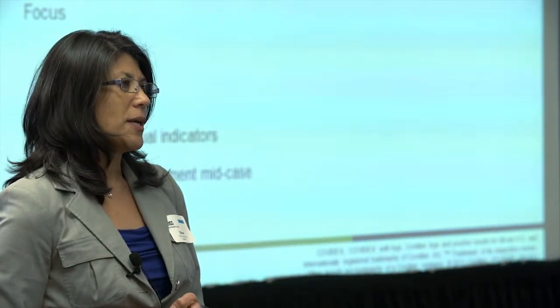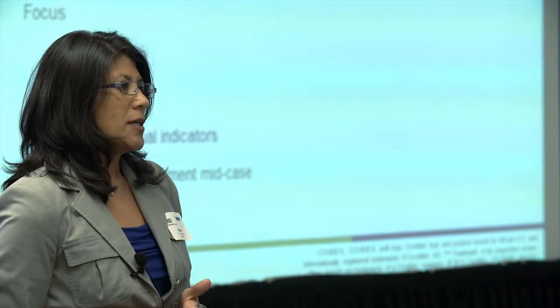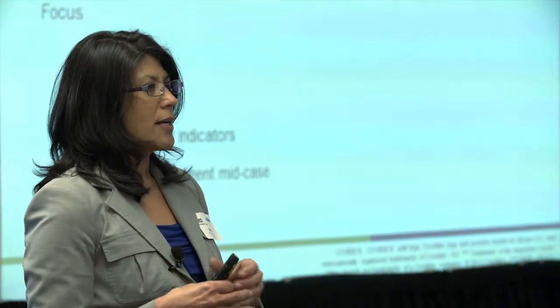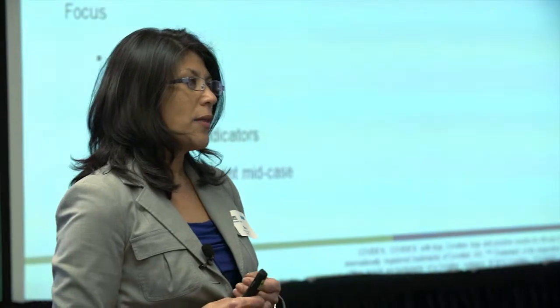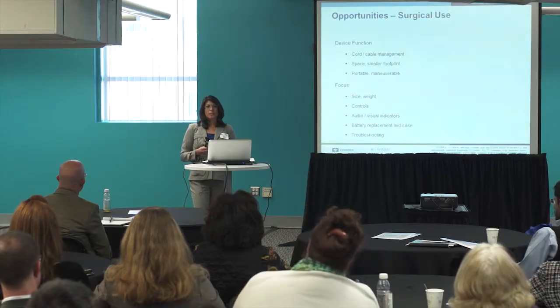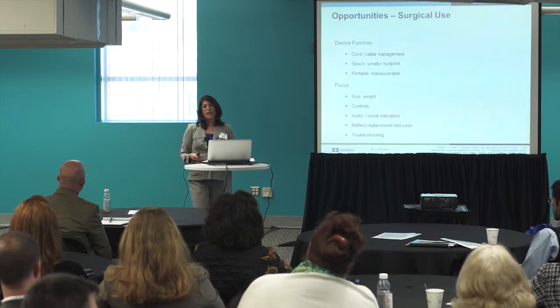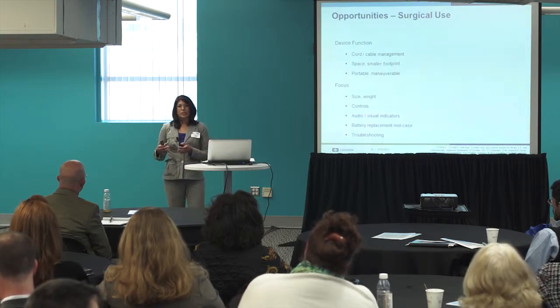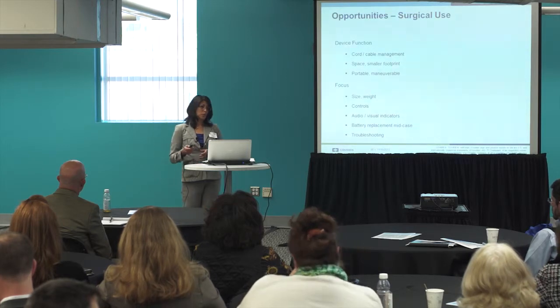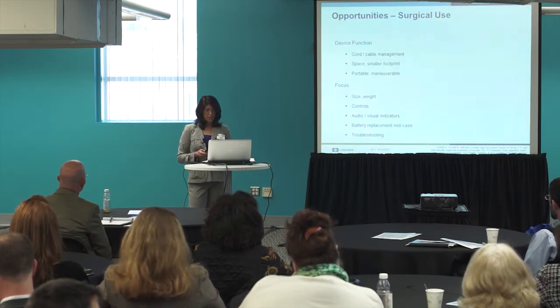So we engaged a surgical advisory group. It was a core set of surgeons that we had as consultants to the company, and they were worldwide. So we were able to solicit information from them from a clinical perspective and also have them do an initial weigh-in on our proposed designs and the controls that we were proposing.